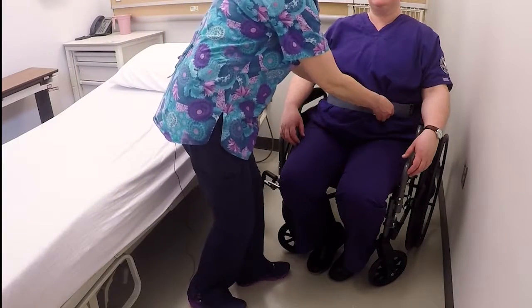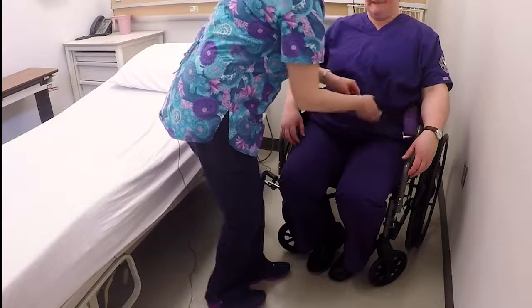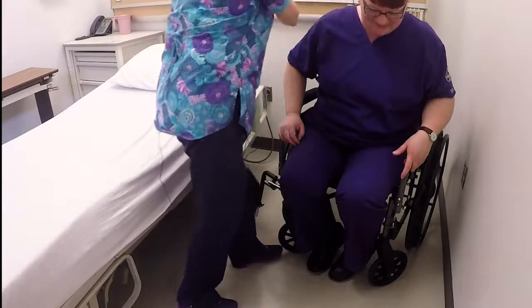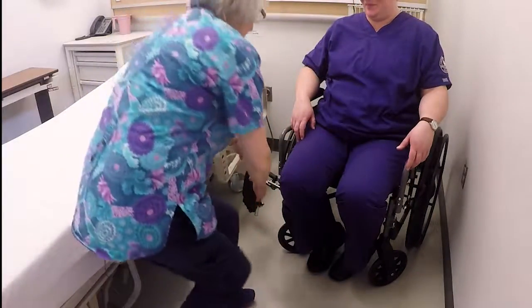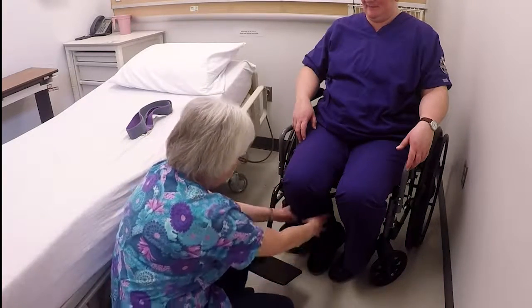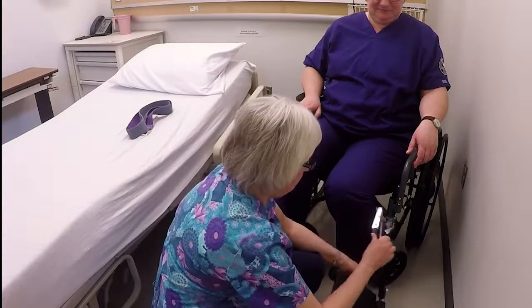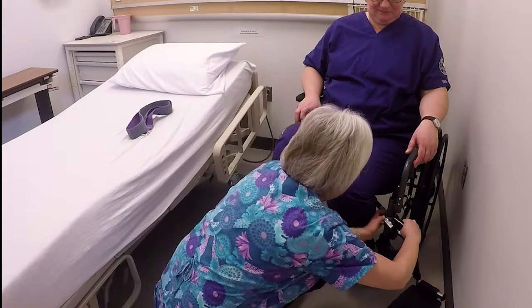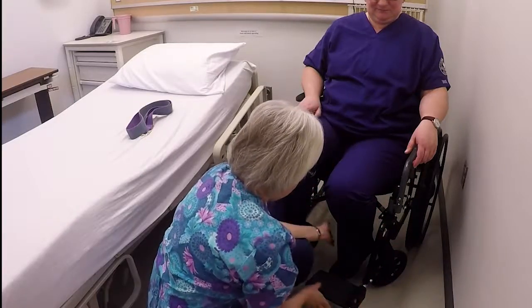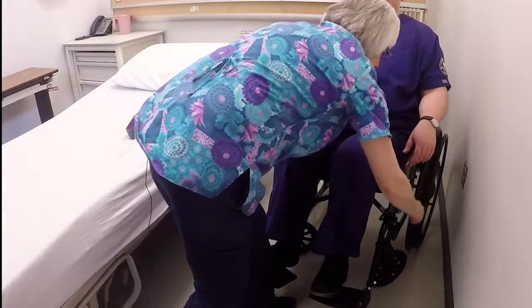Okay, now that she's seated in the chair, I'm going to remove the transfer gait belt. Have her lean forward. Thank you. You can lean back. I'm going to bring her footrest forward now, protecting her leg. Rest her foot up on her footrest. Put them on over here. And I'll unlock her wheelchair brakes.